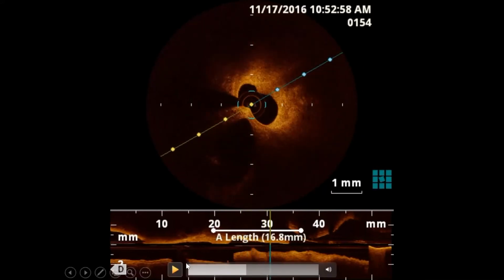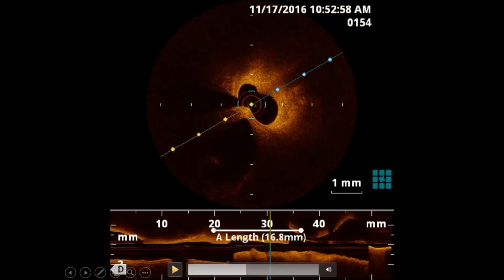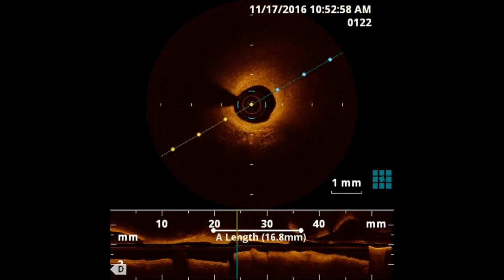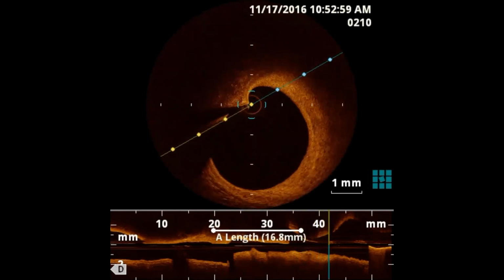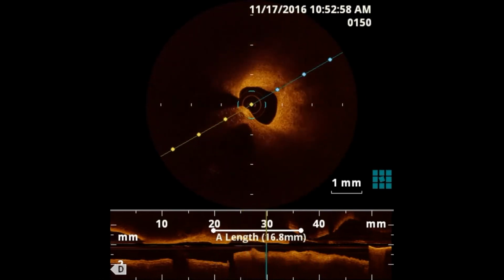So I think what we are seeing here is that there is a small area of proximal LAD where there is a significant lesion. Because of the tortuosity or whatever the angles, it was not that much appreciated on the angiogram, but this is the area where the lumen looks quite tight. Otherwise, the rest of his arteries were not too bad. There is plaque, but the left main is good size, and the distal vessel is also good, but there is a small area of lesion. I don't see an obvious thrombus here, but obviously it also depends on the time scale between the presentation and this picture.